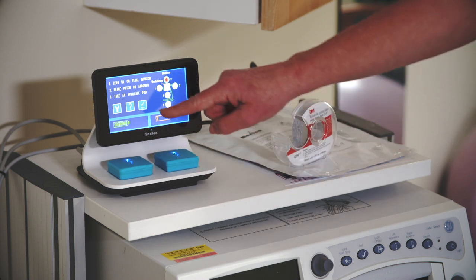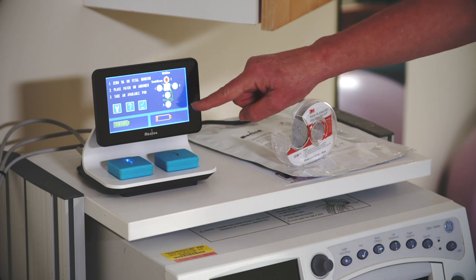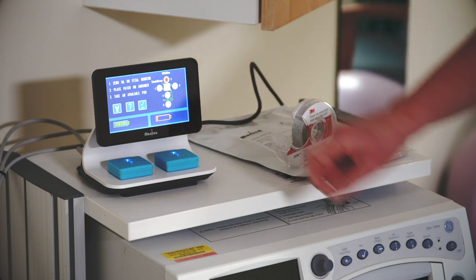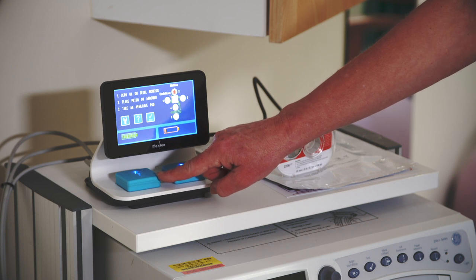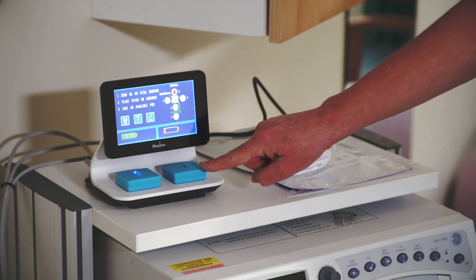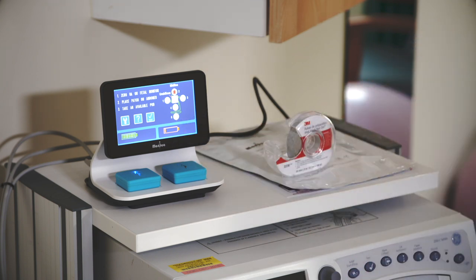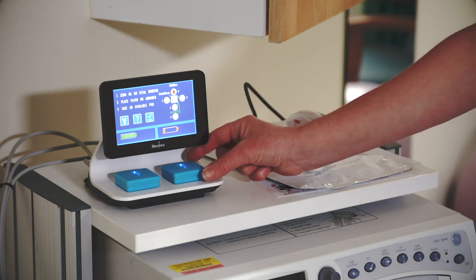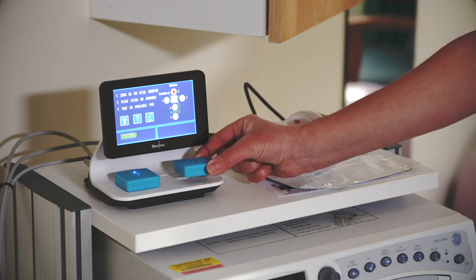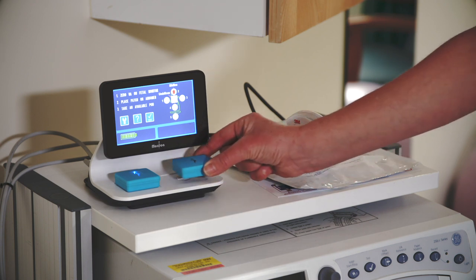A green battery icon is good, indicating a minimum of four hours with up to 11 hours if all green segments are showing. But if it is orange, there will not be enough charge to start a monitoring session. When a pod is fully charged, the blue LED on the pod will be on continuously, and when the pod is charging, the LED will flash slowly. If you remove a pod when the battery icon is orange, it will turn off, the battery icon will disappear from the display, and the blue LEDs will turn off.